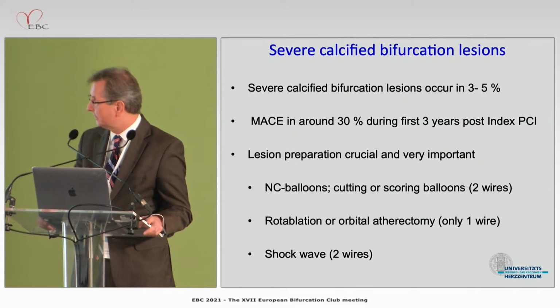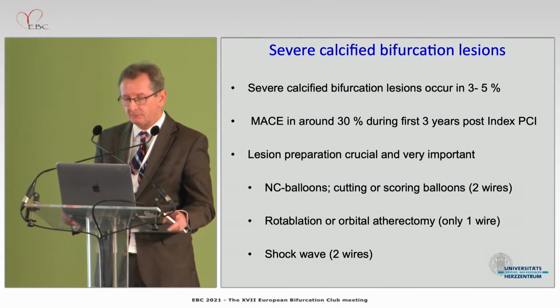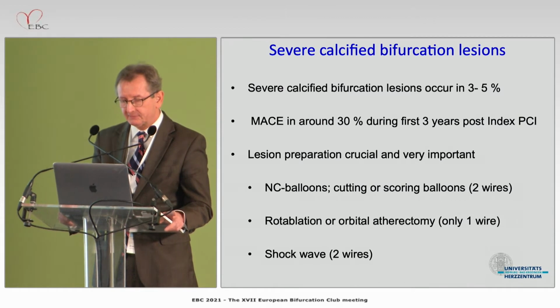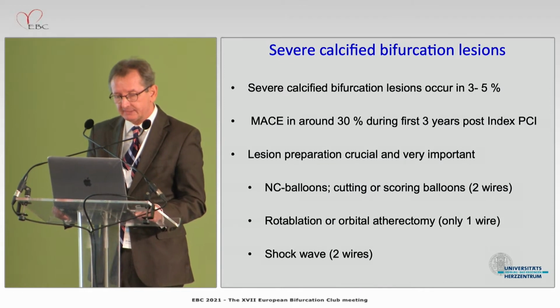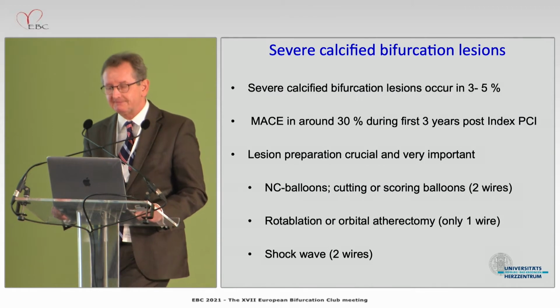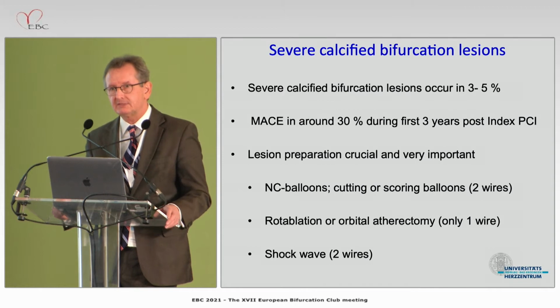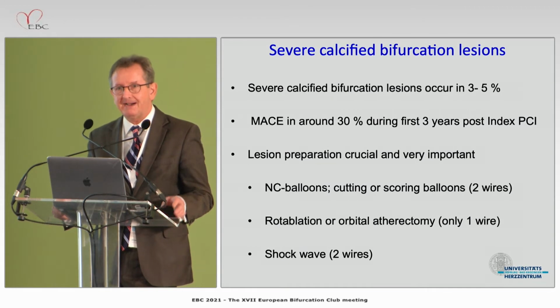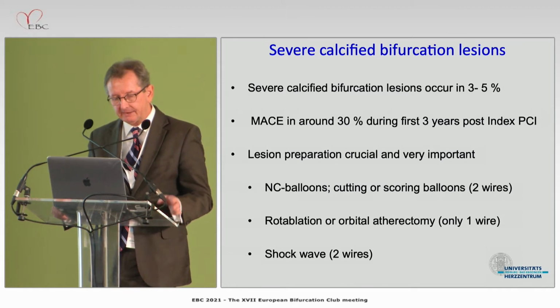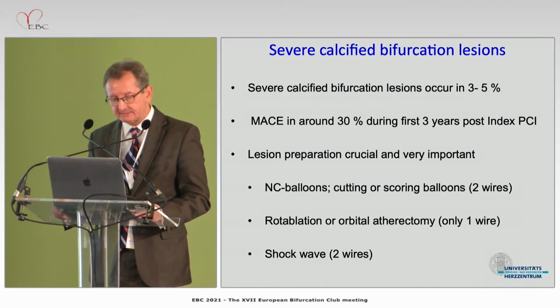And as you can see here, according to our data from more than 2,100 patients with coronary bifurcation lesions from our registry data, we will find in up to 5% really severe calcified coronary lesions. And if you follow such patients up to 3 years, you will find in every third patient the need for TLR and including MACE. So the lesion preparation is extremely crucial.